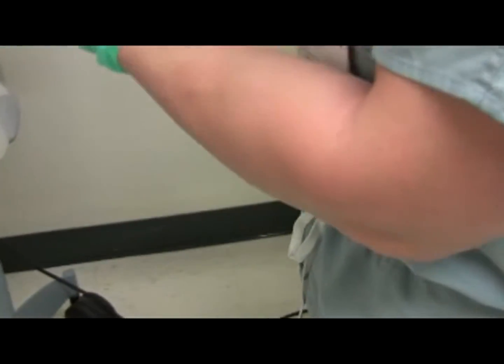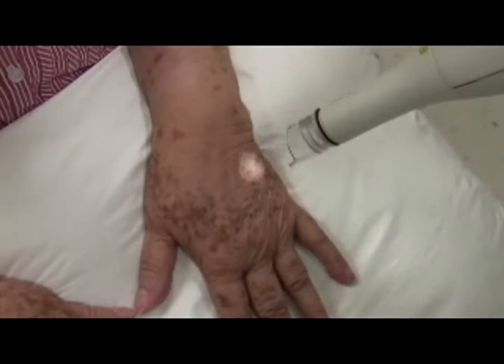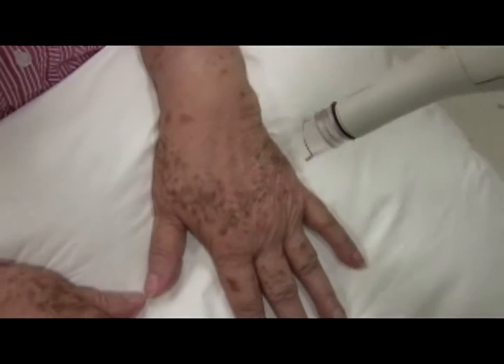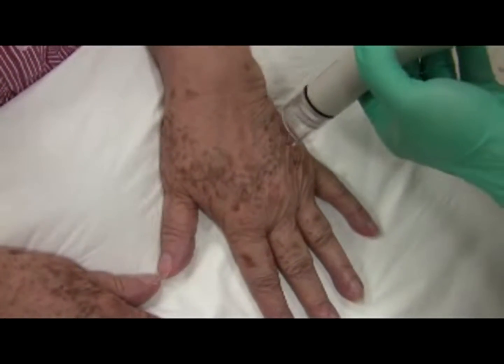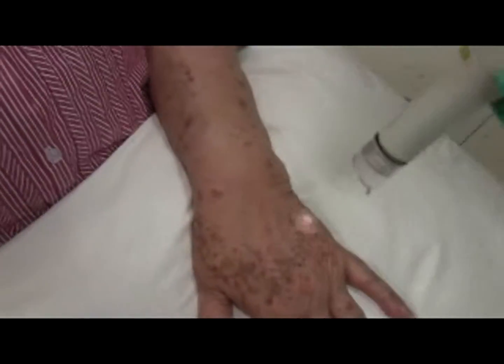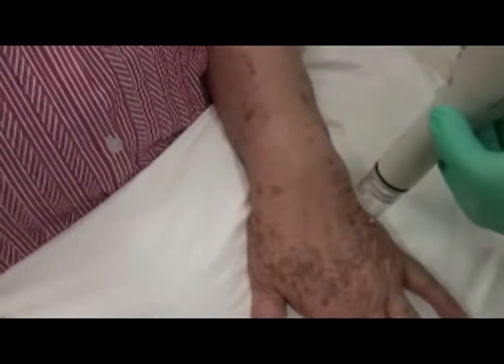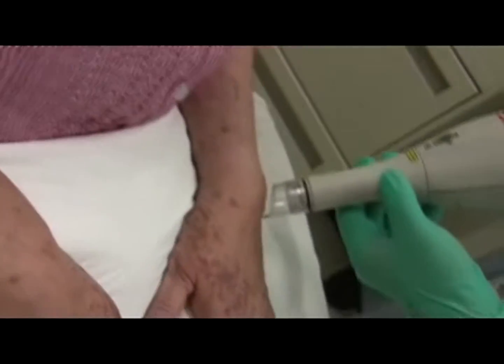Hold the tip such that the most distal aspect of the plastic tip touches the patient's skin. Holding it much further than a millimeter from the target will decrease the efficacy of the laser. The handpiece should be held perpendicular to the target lesion. When skin is friable or bunched up, I like to splay the skin — this applies to laser hair removal as well.